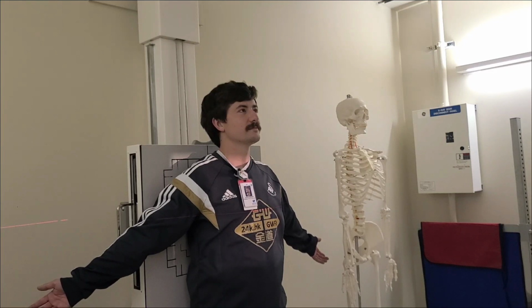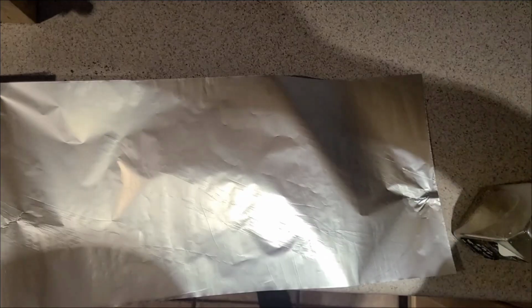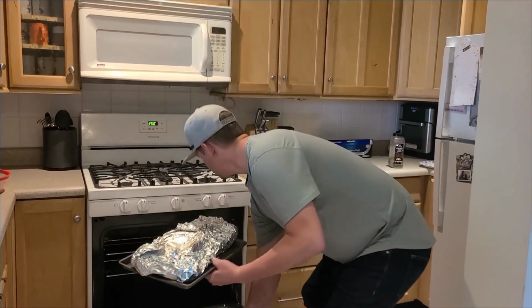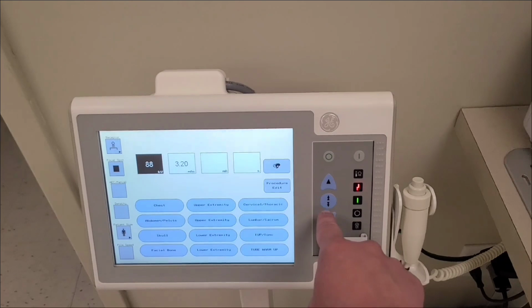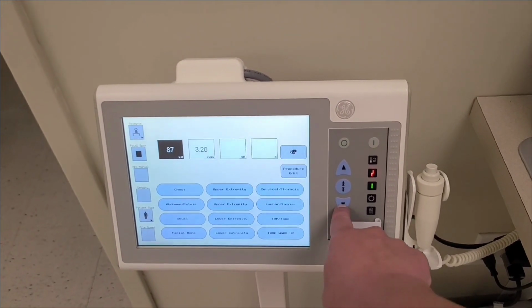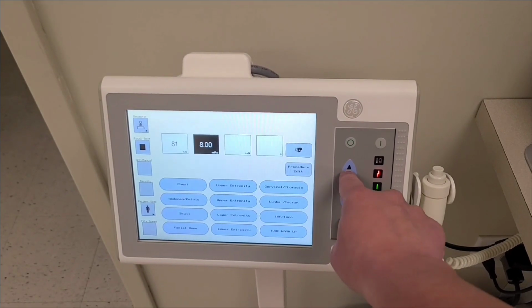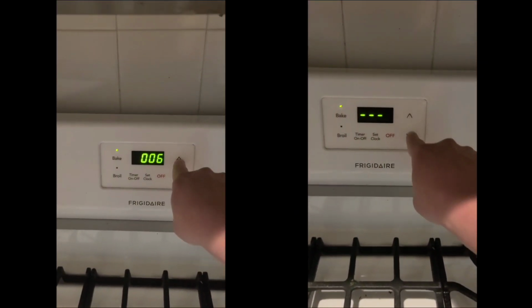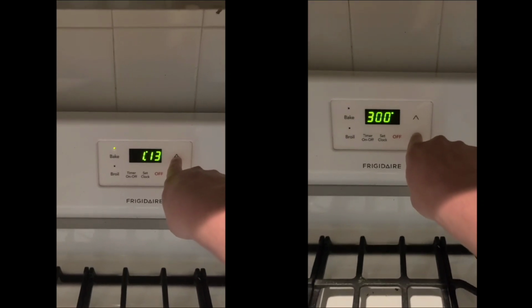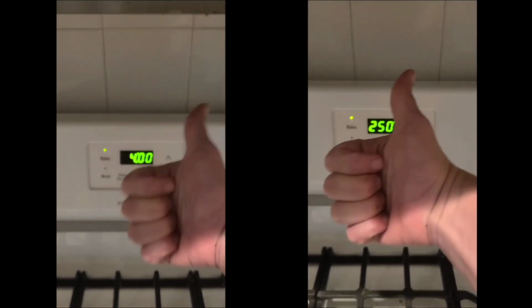Our central ray will enter perpendicularly at the level of the xiphoid process, or, if our pain were any lower, midway between the xiphoid and the lower margin of the ribs. Our technique will vary slightly from exposure to exposure, as we will need our heterogeneous X-ray beam to penetrate through slightly more tissue in the oblique projections. For our first projection, we will set our technique to 80 kVp at 10 mAs. This will allow our X-ray beam to penetrate and black out the patient's lungs while allowing the ribs to attenuate the X-ray beam, creating a clear radiograph of the anatomy of interest.